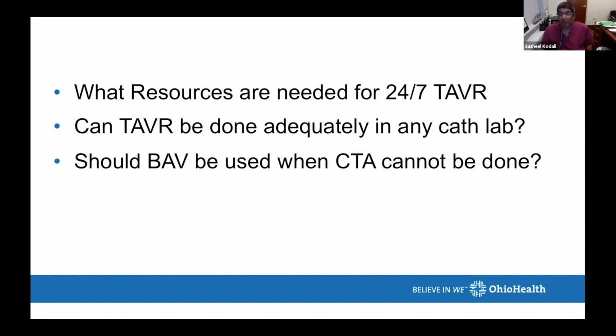But I think we would all agree that the best chance of that patient recovering, especially with severe LV dysfunction, when TAVR was a 24 French sheath and BAV was a 12 French sheath, it was an argument, right? Now you're 14 French, and in the argument, yes, the infection risk. So if someone's infected, that's a different scenario because you risk infecting the valve.